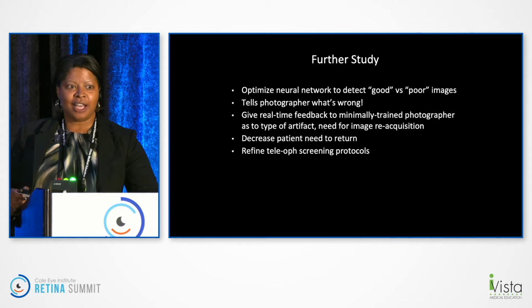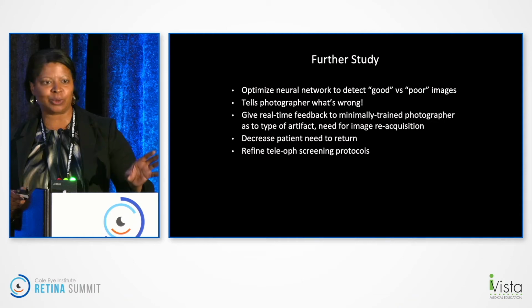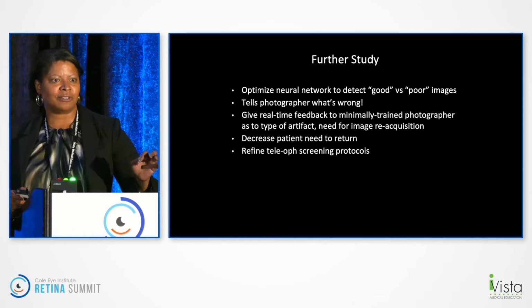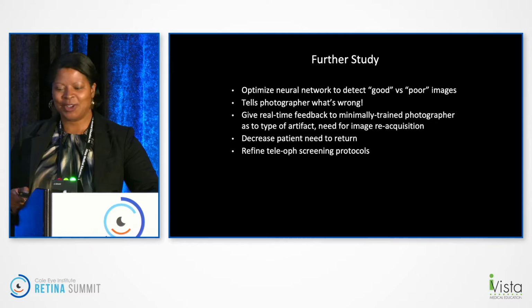reacquisition. And my goal with some of this is to refine sickle cell retinopathy screening protocols, to have some ability to put these imaging capabilities in low resource settings. We're not going to have trained photographers at our behest all the time. We need to be able to give the photographer some feedback, and that can minimize the patient needing to return, and then refine our teleophthalmology screening protocols.